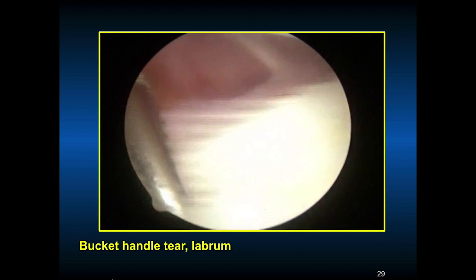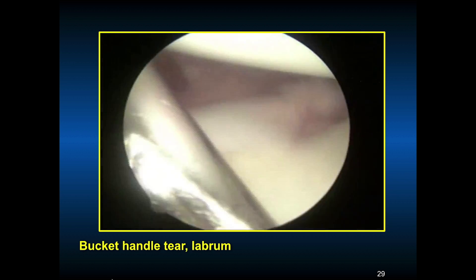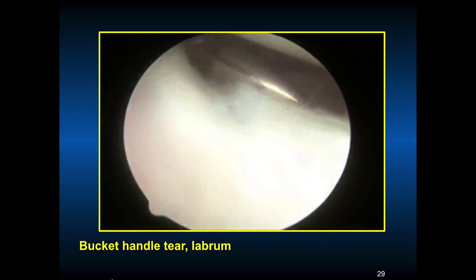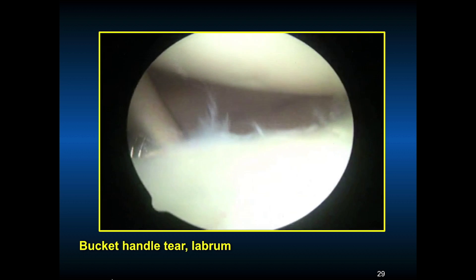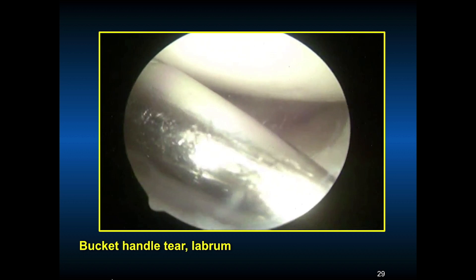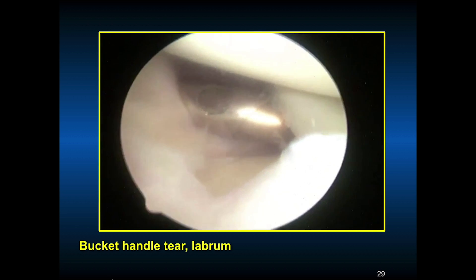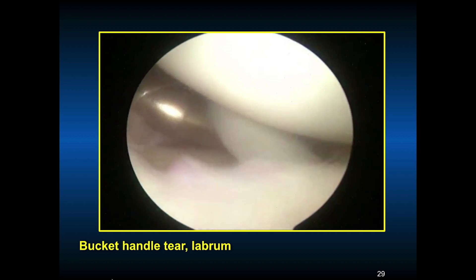So what do we do with this? Can we fix it? Do we have to take it out? What do we do with the biceps with a bucket handle tear? This also shows his anterior inferior instability. If we can get the scope over that bucket handle tear, he also has a Bankart lesion. Can we repair this — go 360 — or do we have to remove part of it?